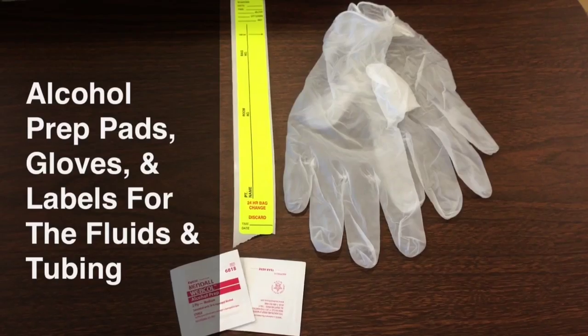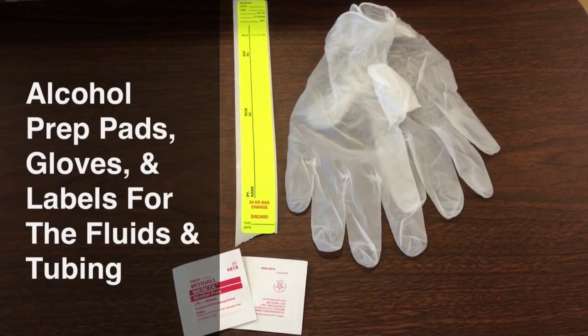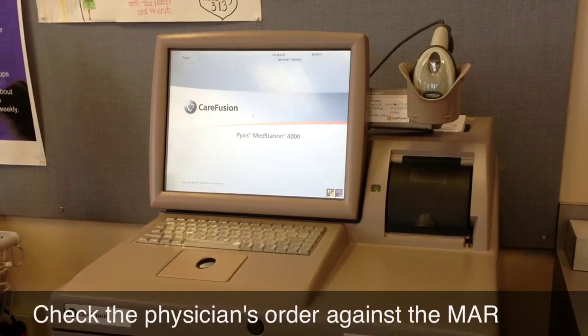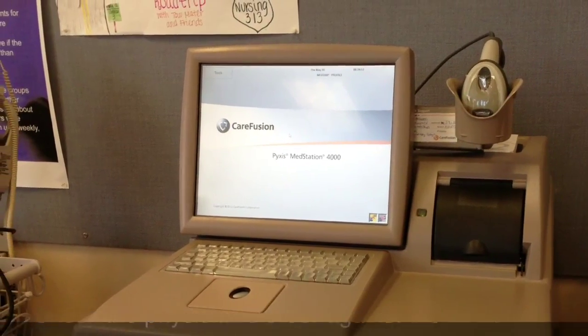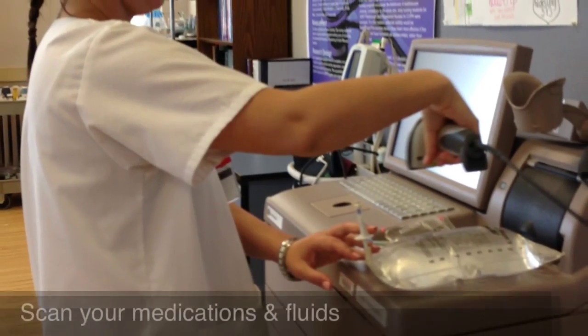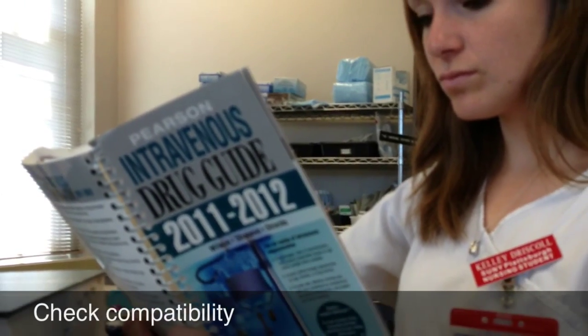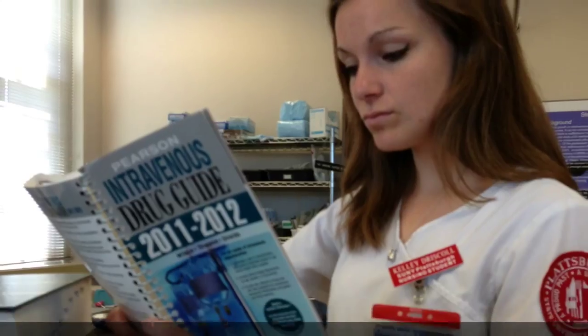Last but not least, you're going to need alcohol prep pads to clean the port, gloves to protect yourself from the medication, and labels for both your bag and IV tubing. You never know when a mistake can be made, so you always want to check your orders just to be sure. Once you've got the right medications and fluids, you're going to scan them.